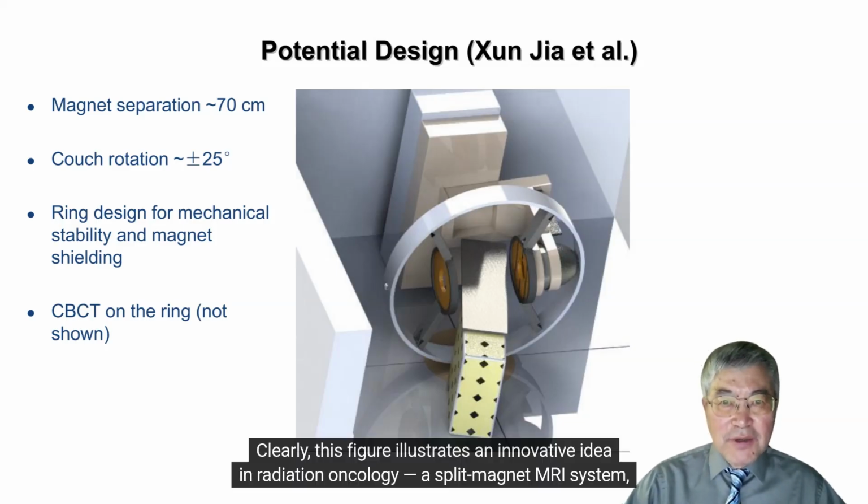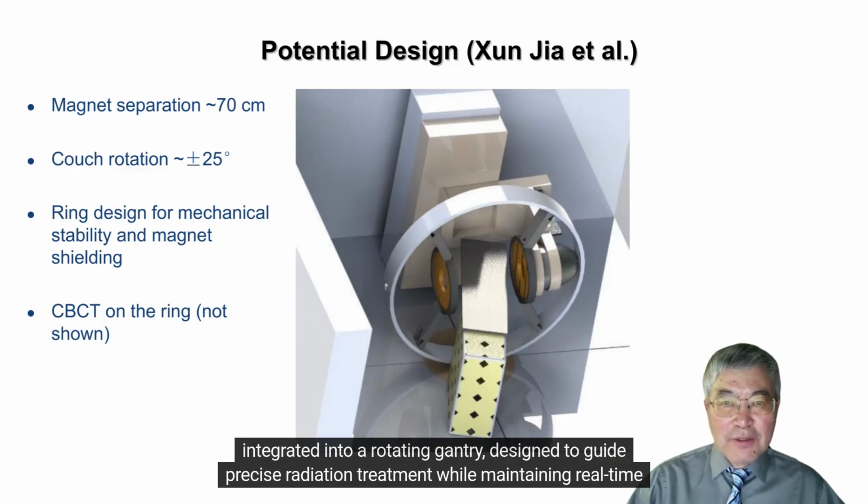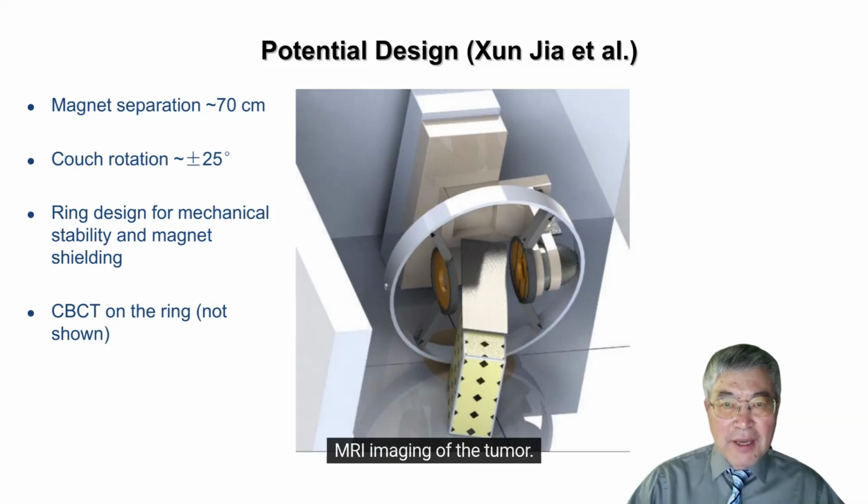Clearly, this figure illustrates an innovative idea in radiation oncology: a split magnet MRI system integrated into a rotating gantry, designed to guide precise radiation treatment while maintaining real-time MRI imaging of the tumor.